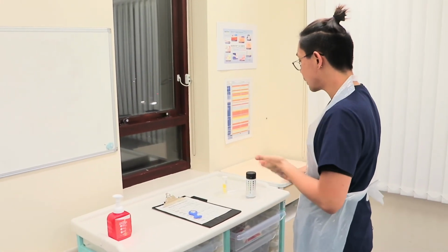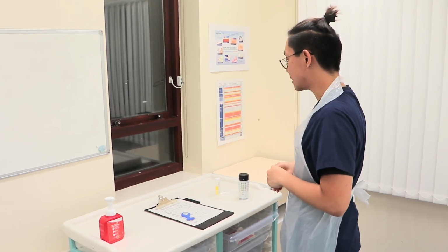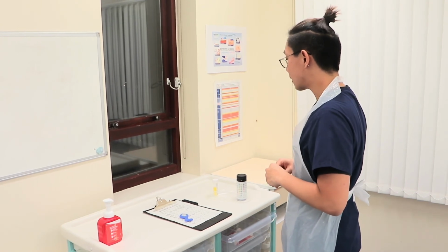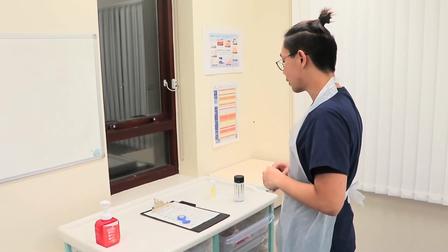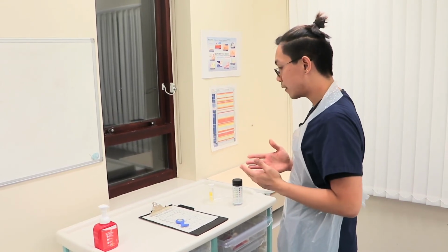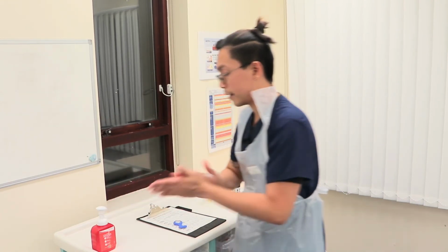And make sure to dispose of the specimen in the clinical waste bin or set it aside as per hospital policy if the doctor wants to do another test on it. The multisticks will be placed back in the cupboard or as per manufacturer's policy, and the tray will be cleaned and disinfected for the next use. Now my apron and gloves will be disposed of in the clinical waste bin, and now I'm going to do my final documentation and final hand washing.